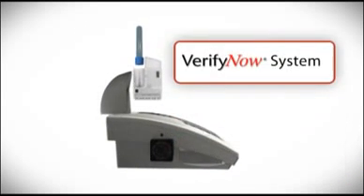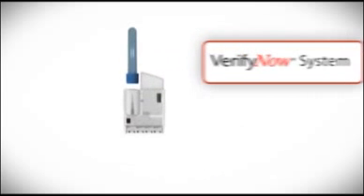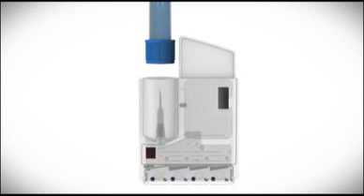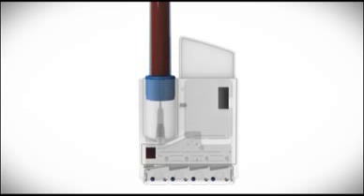After the test device is inserted into the instrument, a whole blood sample collected from a patient dosed with an antiplatelet therapy is inserted into the round opening of the test device. This is called the sample well. This well contains a needle that aids in drawing the blood sample from the tube into the test device. No sample manipulation or processing is necessary.